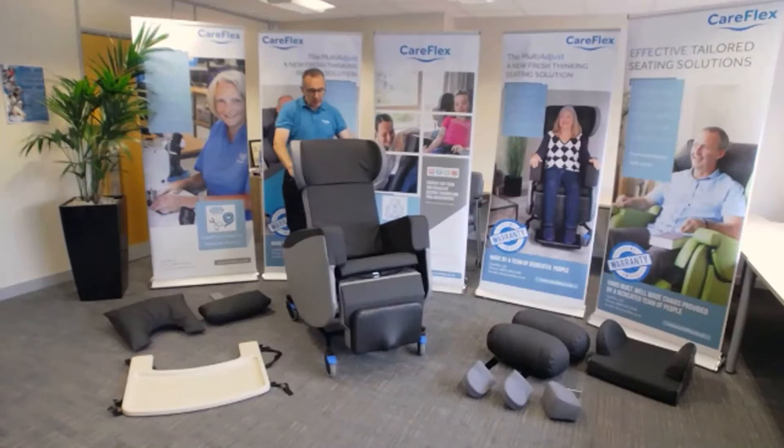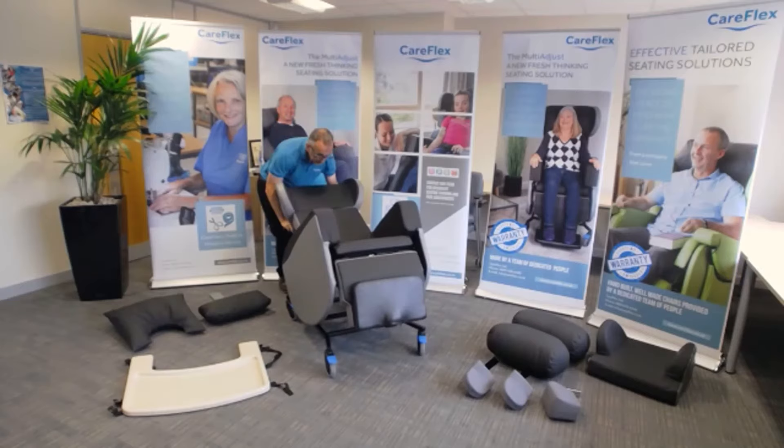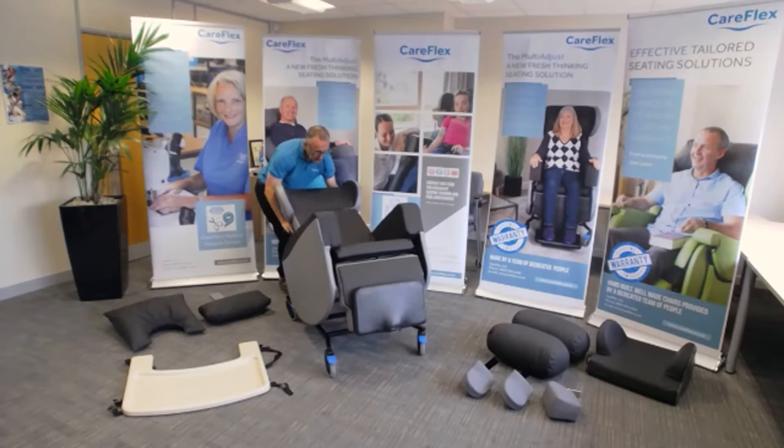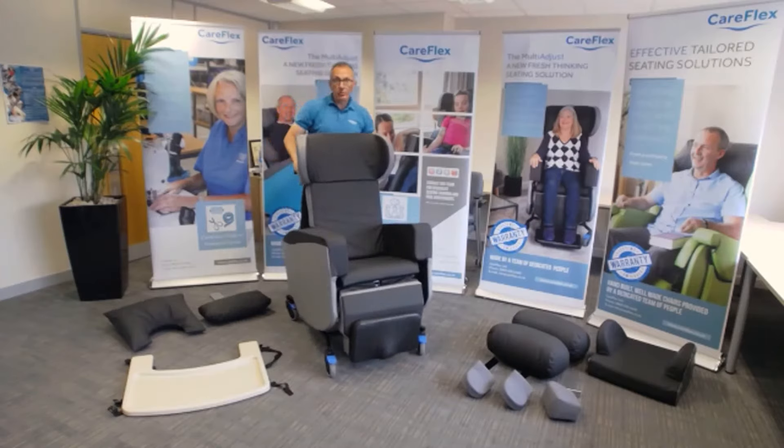The multi-adjust chair is a chair with built-in tilting space and back angle recline. It has 35 degrees of tilting space, plus an option to provide negative angles so that the chair can tilt forward for semi-ambulant clients. Back angle recline is 40 degrees, from 95 to 135 degrees.